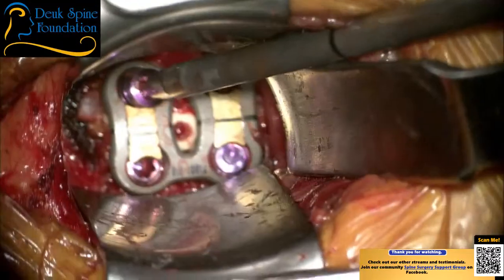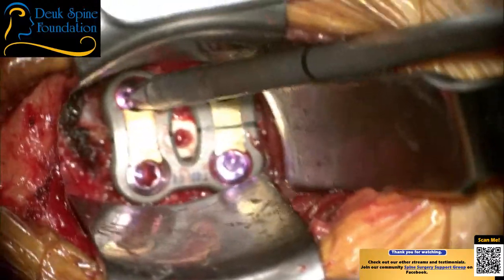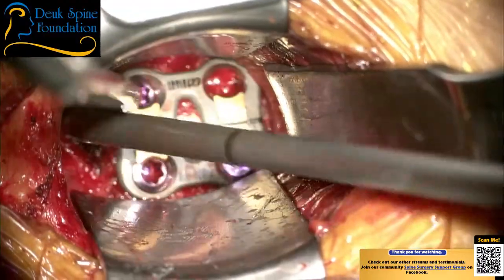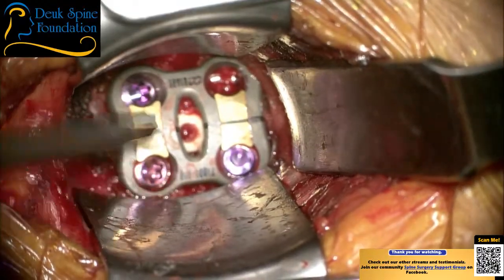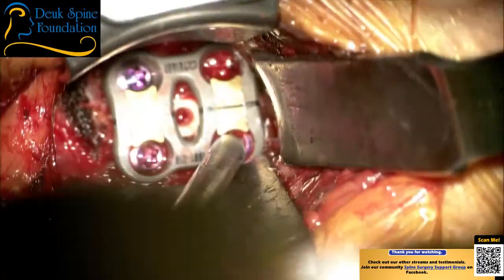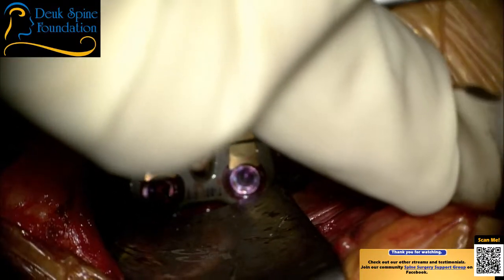And notice how the top of my plate doesn't go past the middle of the vertebral body. So many surgeons make these sloppy mistakes. They'll put the top of their plate way up here so it's rubbing on the next disc. Well, then that means you're going to be coming back for another surgery, folks. If that metal plate is rubbing on a disc, guess who's going to win? The disc versus the plate. The plate's going to win every time. It's steel or titanium in this case. Okay, it's an alloy.